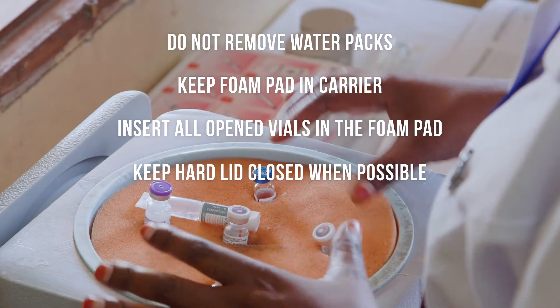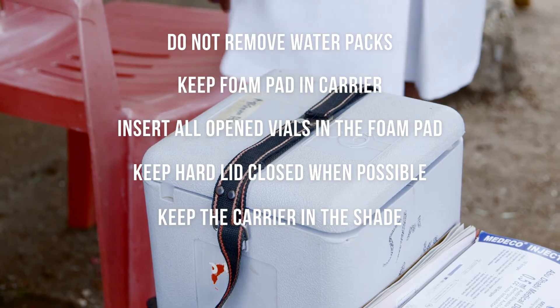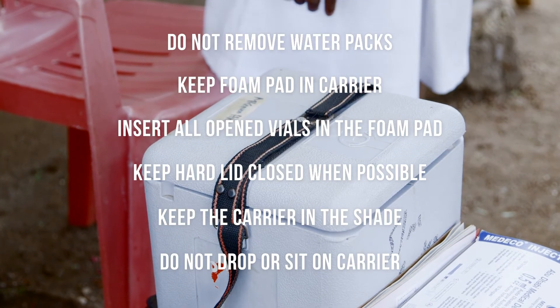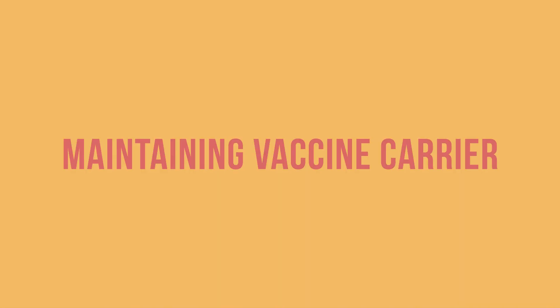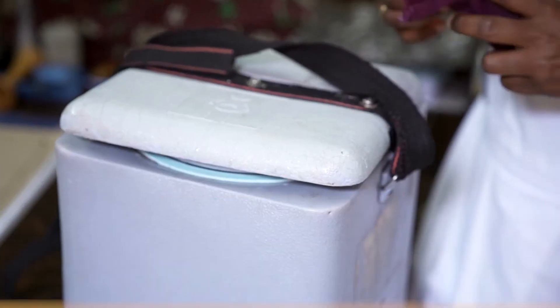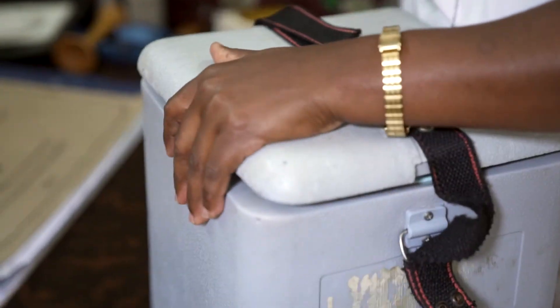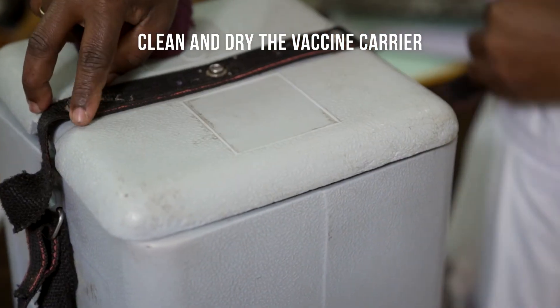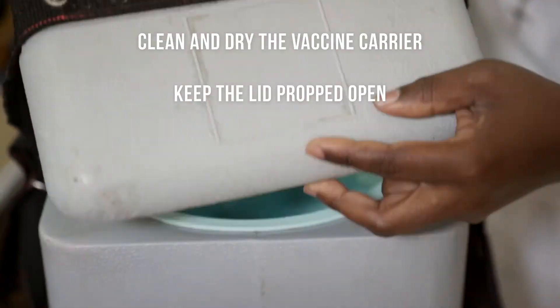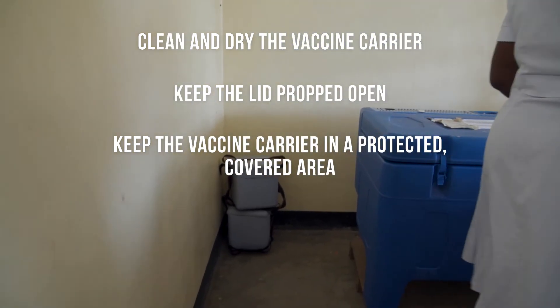Keep the hard lid closed tightly whenever possible. Keep the vaccine carrier in the shade. Do not drop or sit on the carrier. After each session, remember to maintain your vaccine carrier so that it stays in good shape for the next time. Clean and dry the vaccine carrier. Keep the lid propped open and keep the vaccine carrier in a protected, covered area.